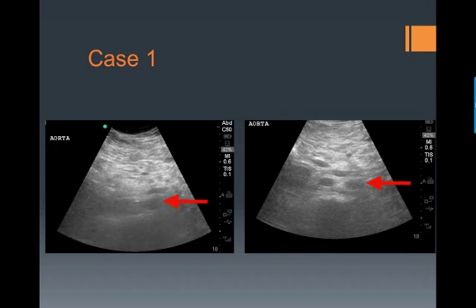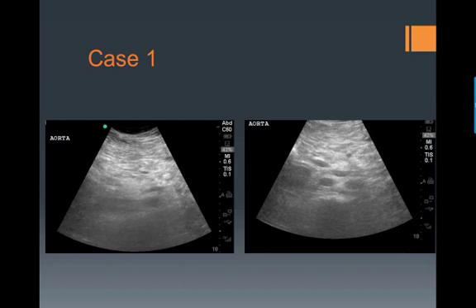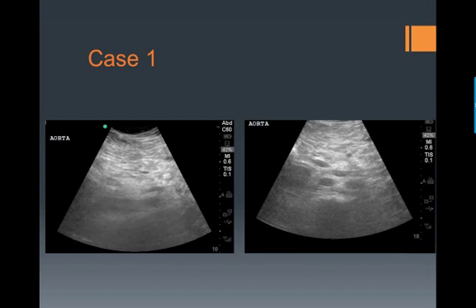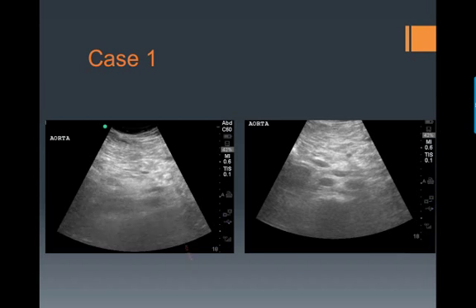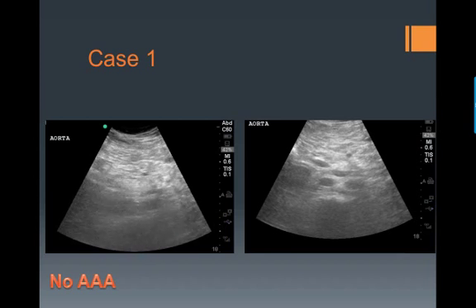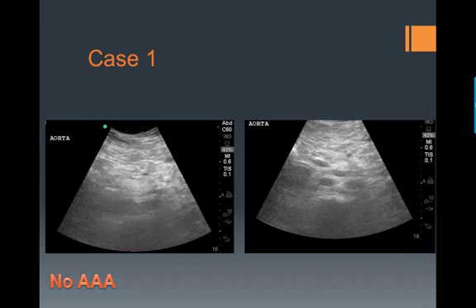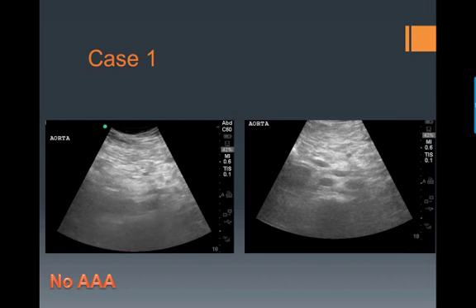If you were to measure this from outer wall to outer wall, you'd get a measurement of about 2 centimeters, so there is no AAA present. However, there could still be a dissection, and the patient needs to be worked up further.